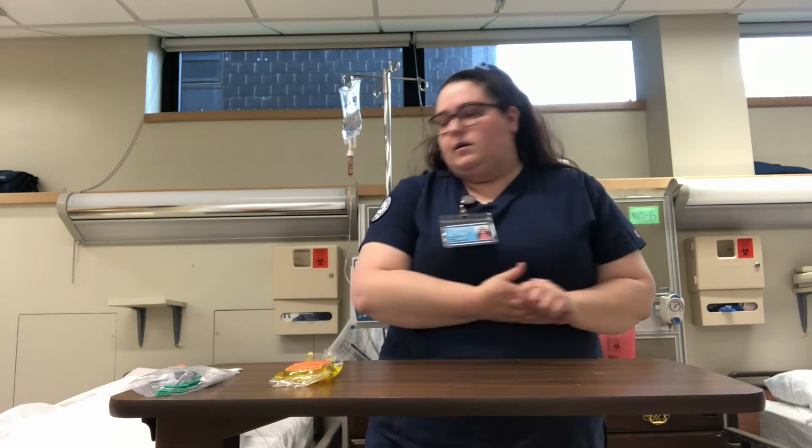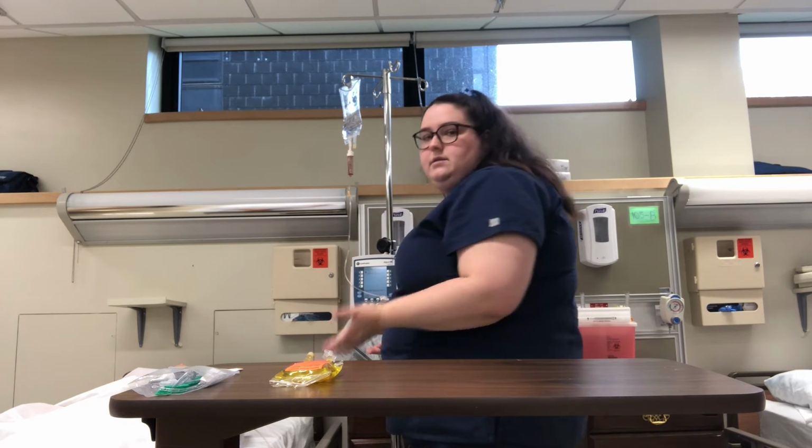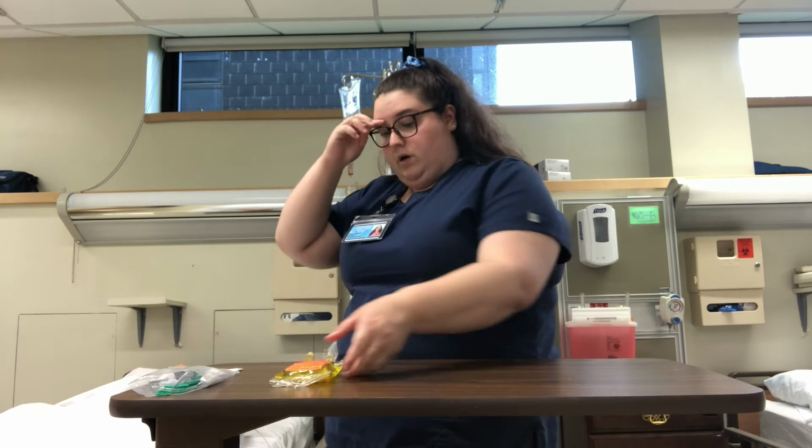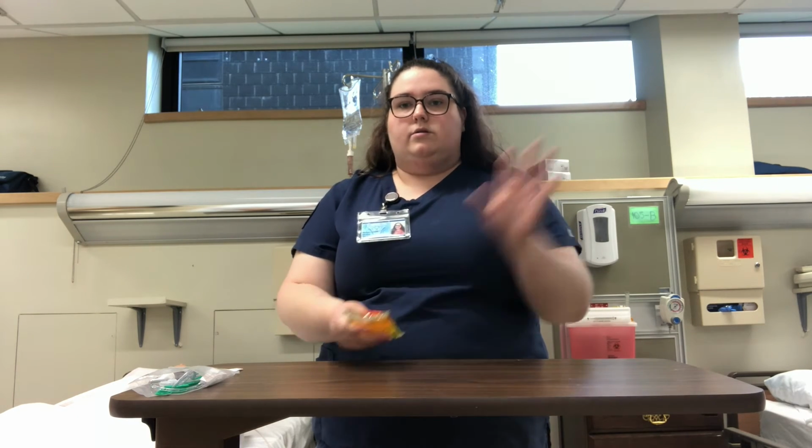Wash my hands again. I'm gonna ask the patient for their name, date of birth, and allergies. I'm going to tell them they're getting an IV infusion of cefazolin because they have pneumonia. And I'm going to scan the medication and compare names on the label to the patient's chart to make sure I have the right medication. This is my third check.